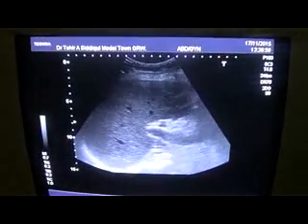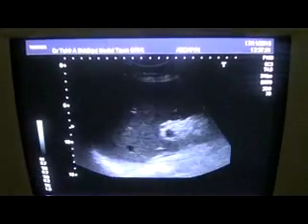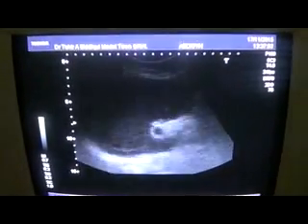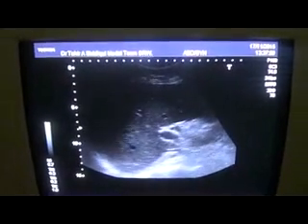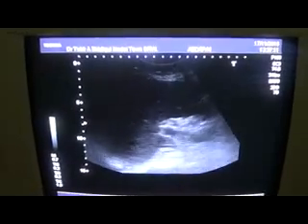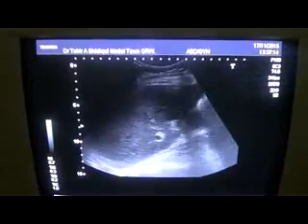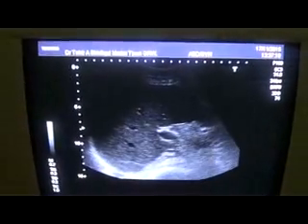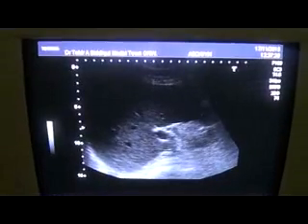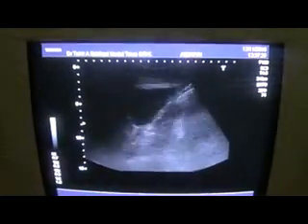Ultrasound of a 65-year-old female with a history of epigastric pains, who has been referred to rule out the cause. This is the liver in front of you with the portal vein and the common bile duct. Intentionally showing you: this is the portal vein, this is the common bile duct, not dilated.